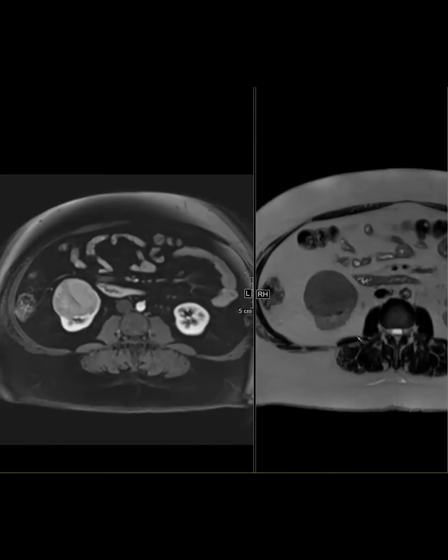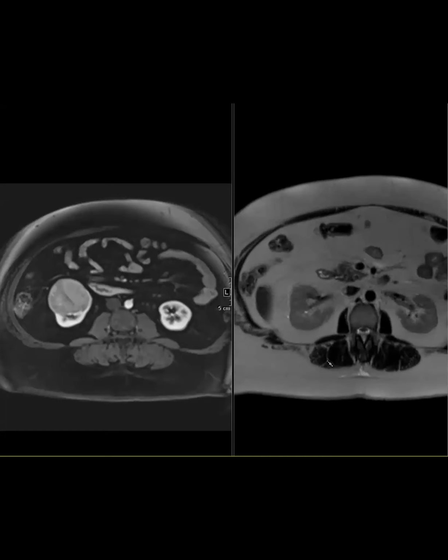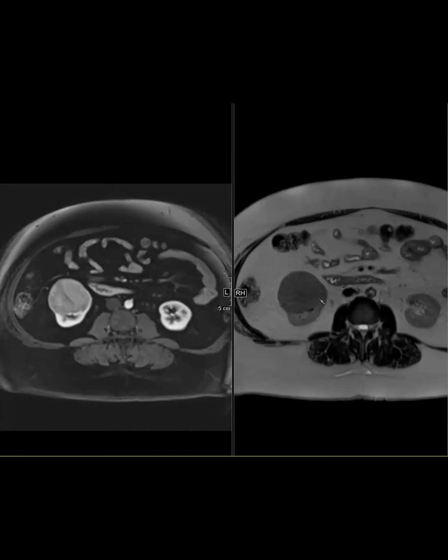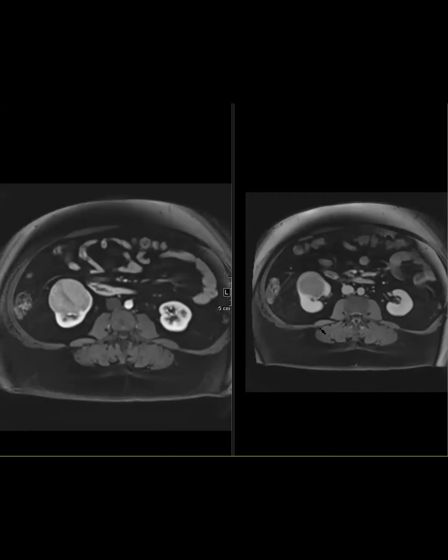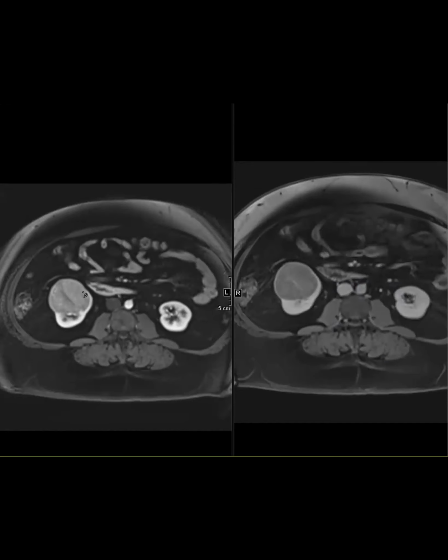No, well, we'll see. So anyway, this was a middle-aged female. She had this renal mass. You can see it's pretty large and it's involving the renal sinus. It's kind of T2 intermediate or hypointense compared to the parenchyma. And then this is the corticomedullary phase. We can see that there is fairly robust enhancement with a central scar. And then when we go to the delayed phase, it basically washes out, but the scar enhances. So does anyone know what that series of findings is called?